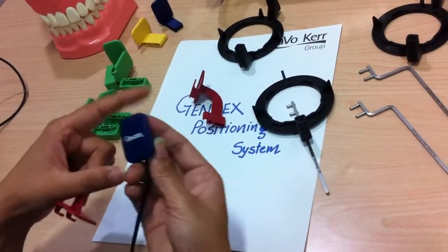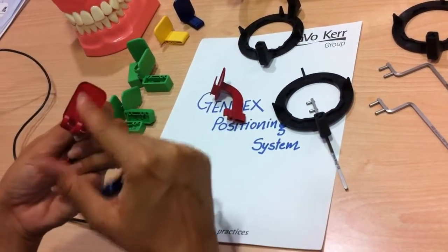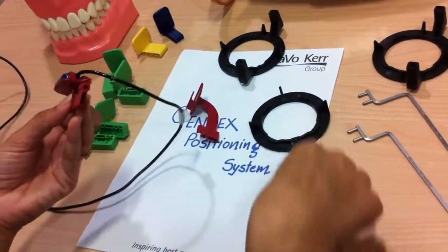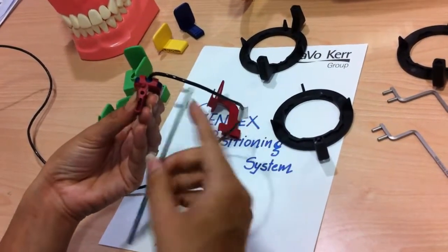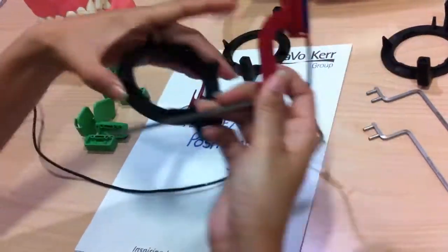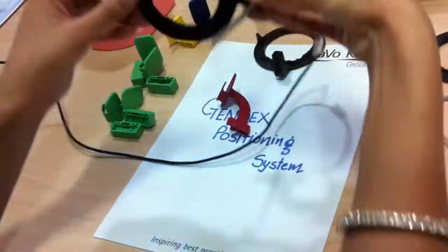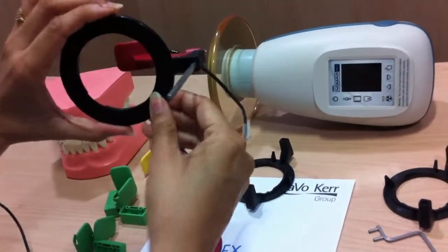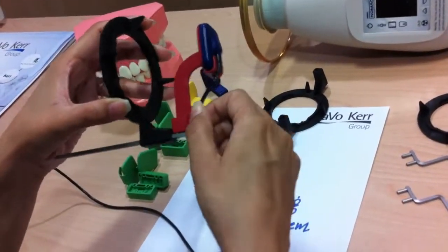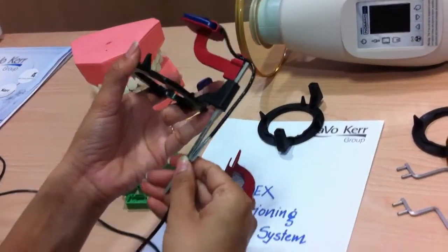The first step is to assemble the sensor on the holder. We need to make sure that the active area of the sensor — the side on which 'index' is written — faces the plate of the holder. Then insert the bar in the given slot. Now the bar goes in the aiming ring. We need to make sure that the sensor is exactly in the center of the ring. There is also a holder for the wire, so you can align the wire in the holder.